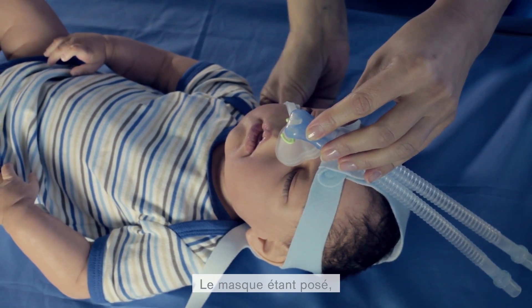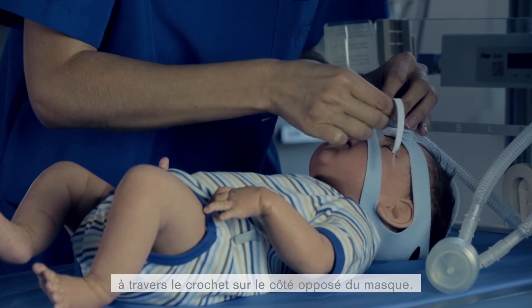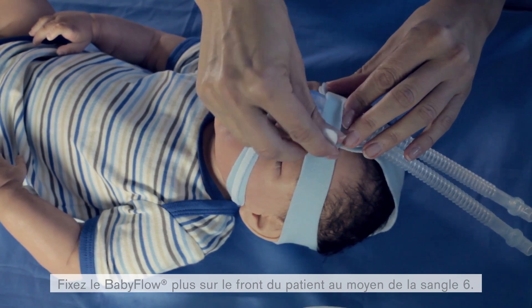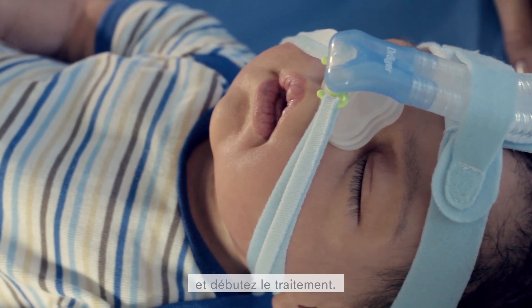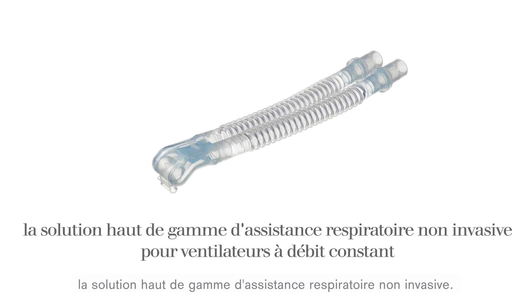Once the mask is set, thread strap 4 and then strap 5 through the clip on the opposite side of the mask. Secure the Baby Flow Plus safely on the patient's forehead by using strap 6. Connect the Baby Flow Plus to the breathing circuit and now therapy can begin. The Baby Flow Plus — a solution for superior non-invasive respiratory support.